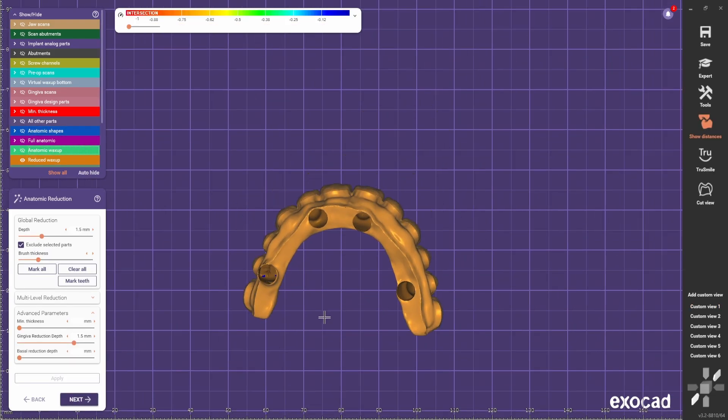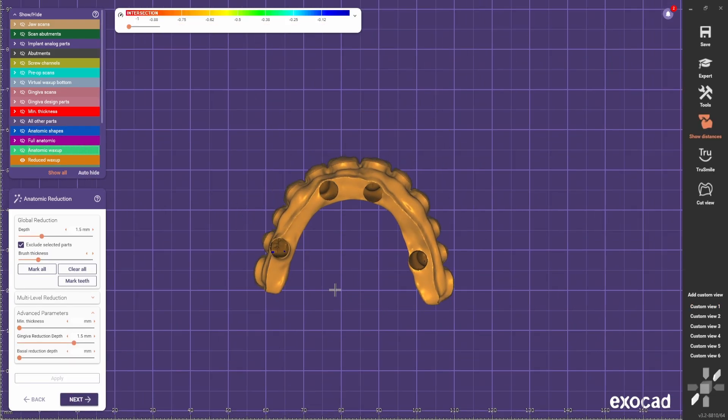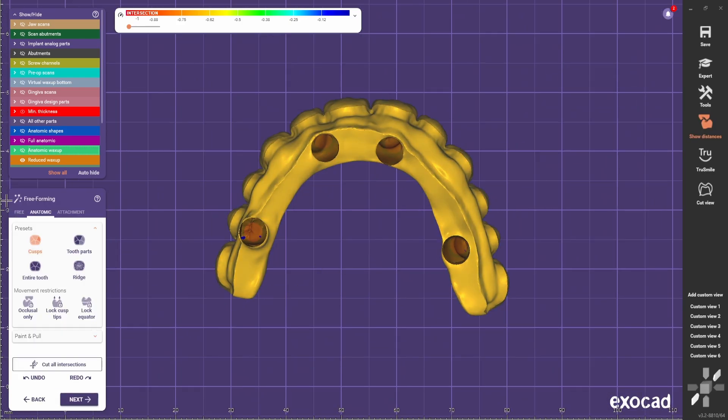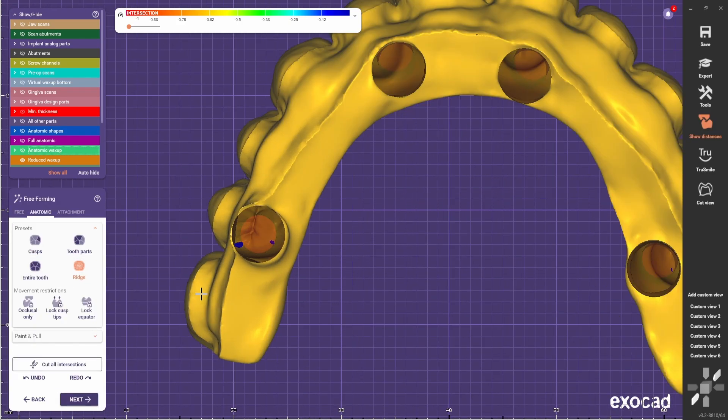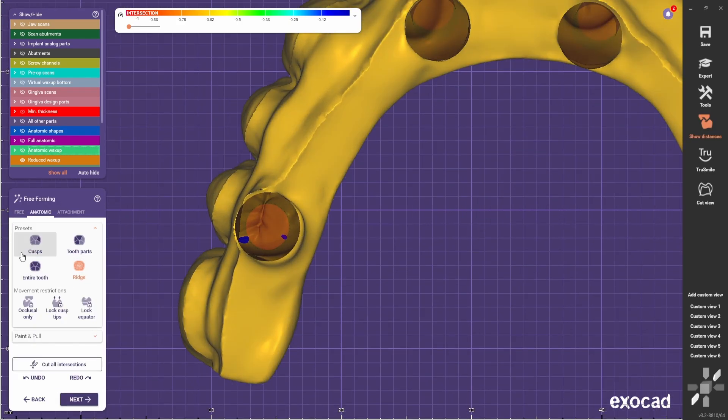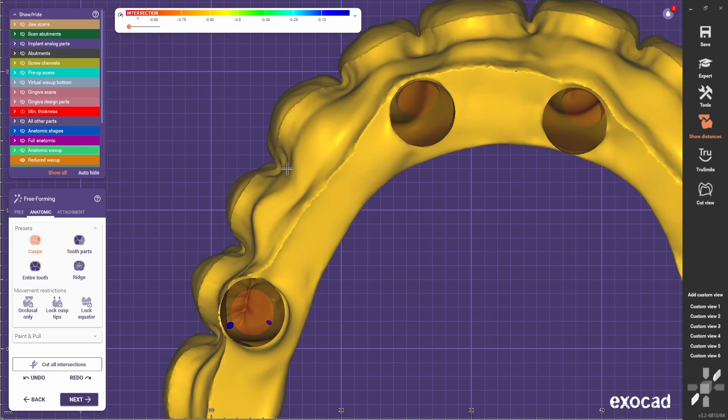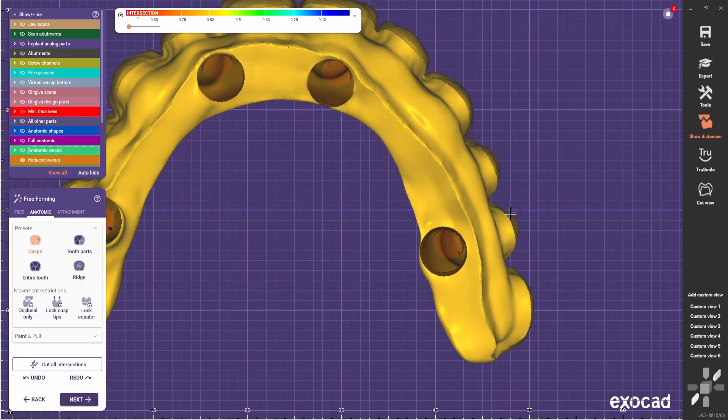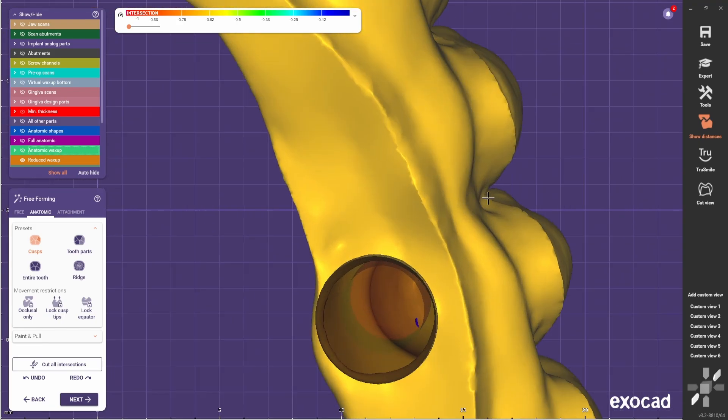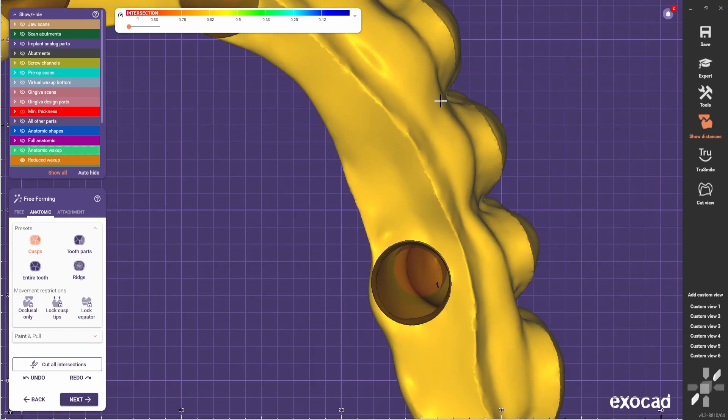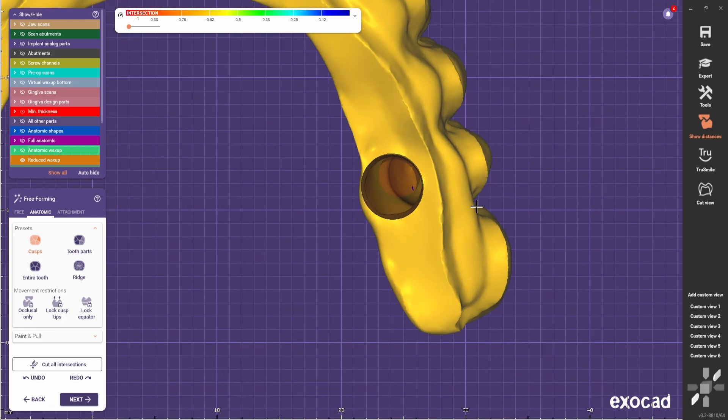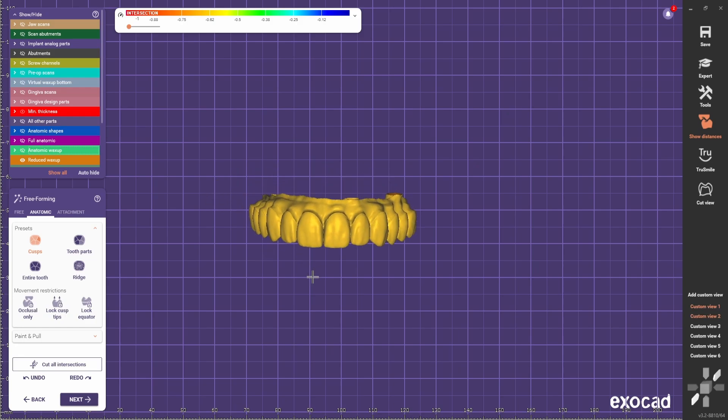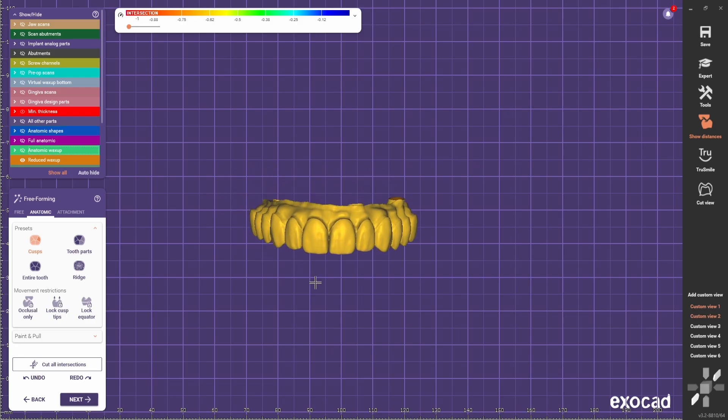And here I just try to expose the embrasures of the teeth, just so I make sure that I have no undercuts when doing the next step. So basically I'm trying to reveal this area where the teeth connect, something like this.